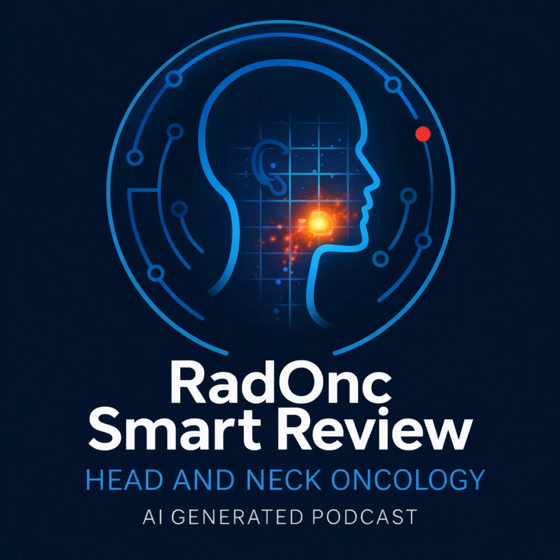So if the surgeon didn't place any clips, we're basically hunting for a subtle change in the grayscale on the CT. That's exactly what you're doing. And let me tell you, surgical clips placed right at that flap native tissue junction are an absolute gift to the radiation oncologist. Always check the op note and look for them on the CT. They confirm the location of that seam that we absolutely must cover. This brings us to the critical contouring principle. This is the core of this whole discussion, and it's emphasized by groups like GORTEC and HNCIG.